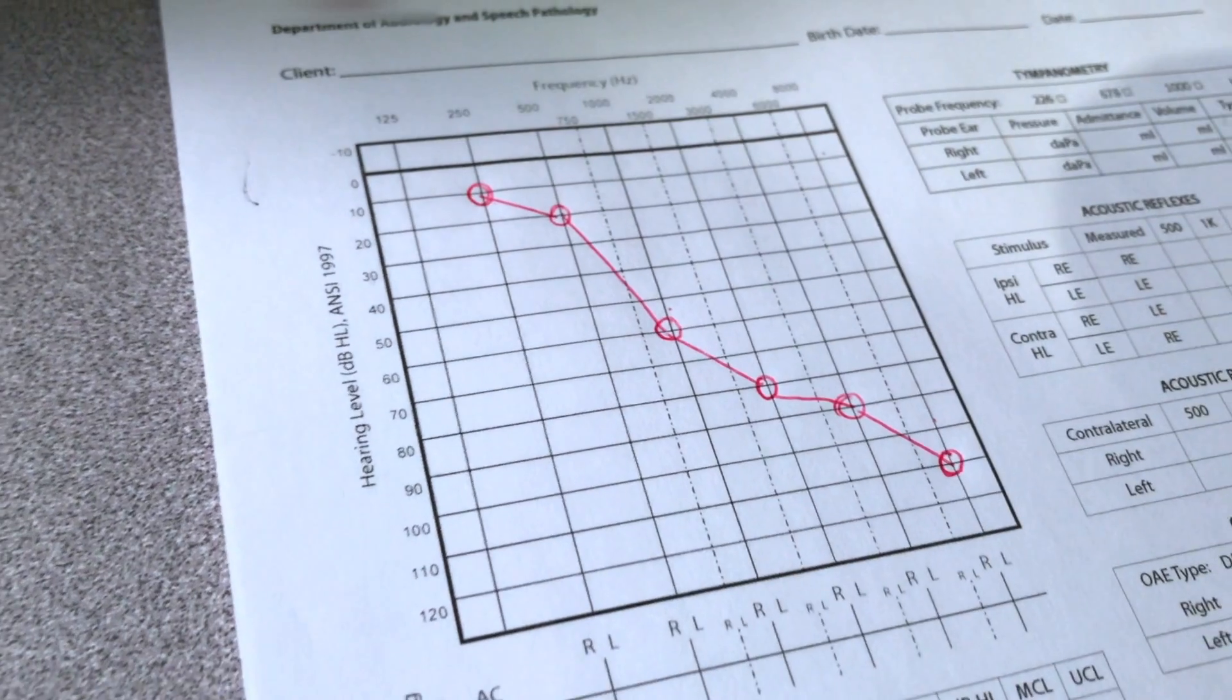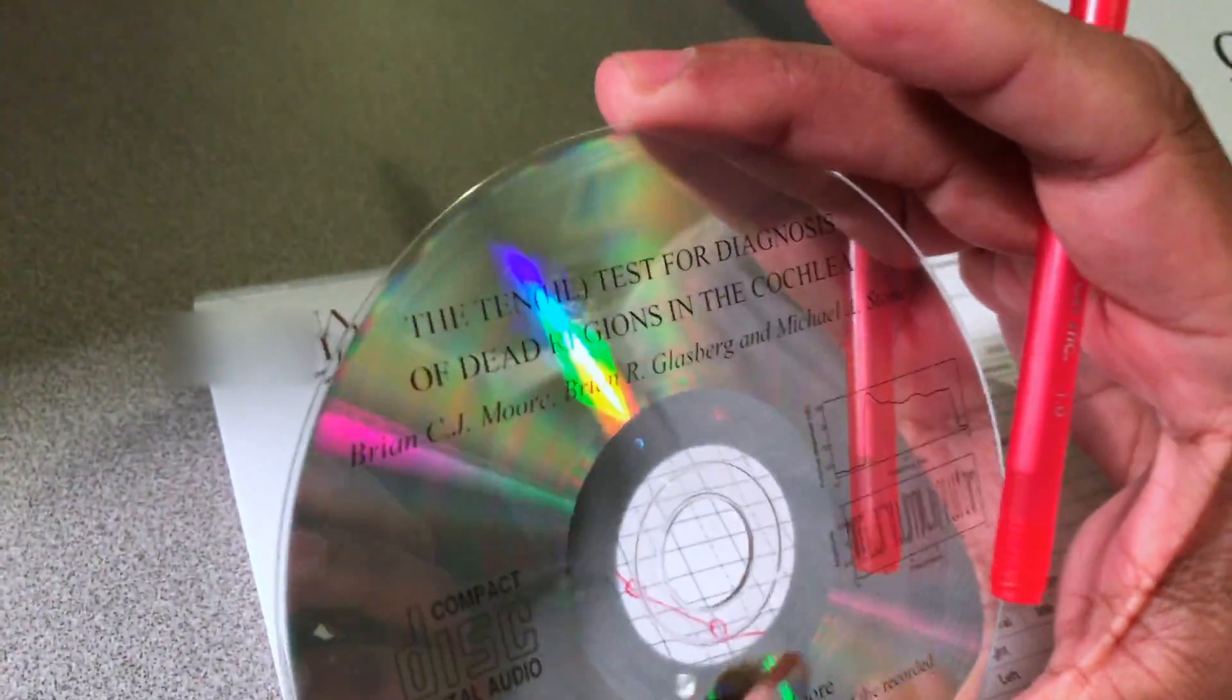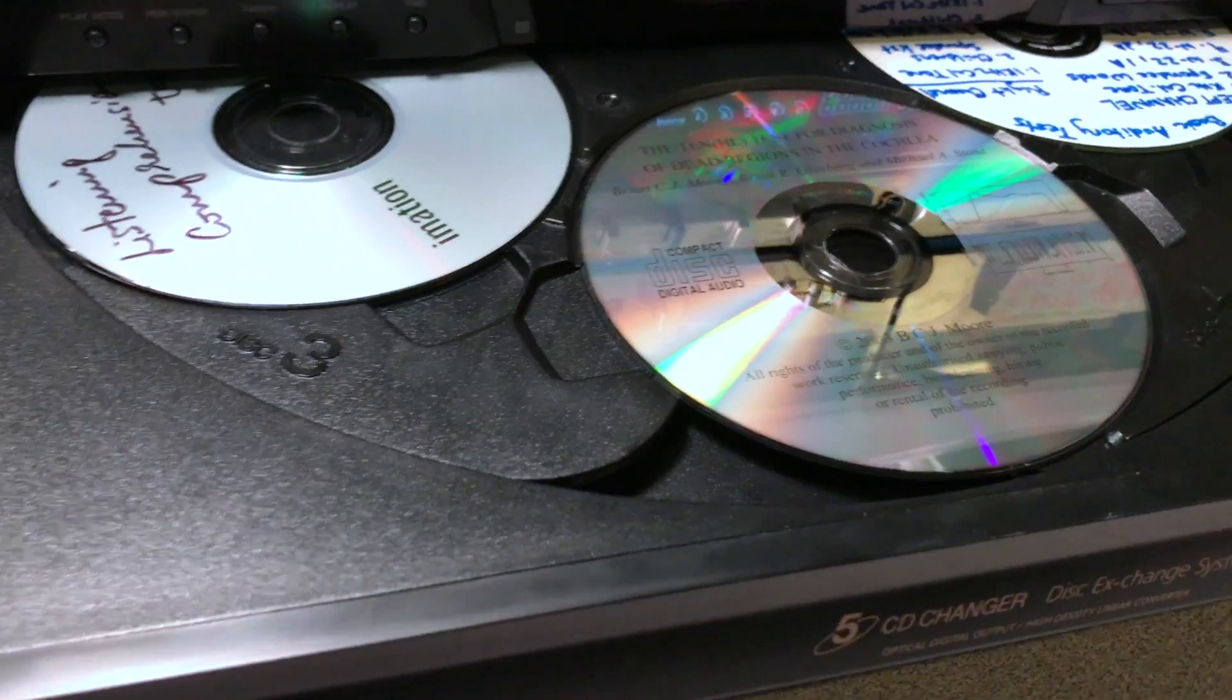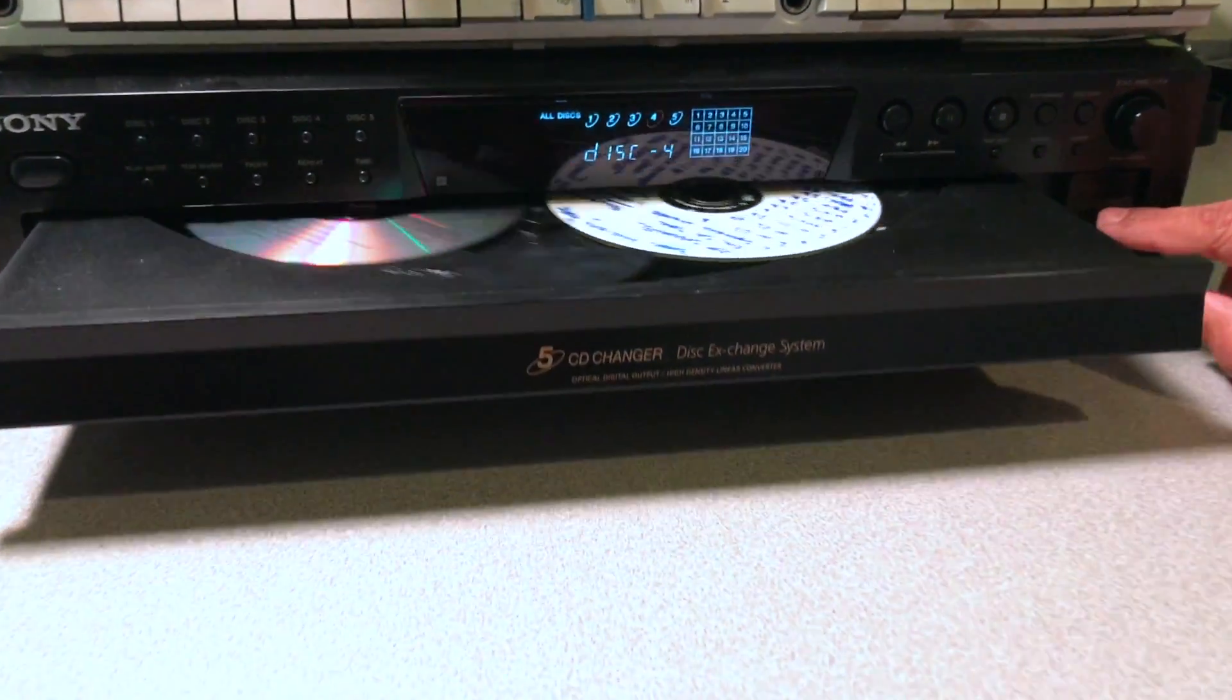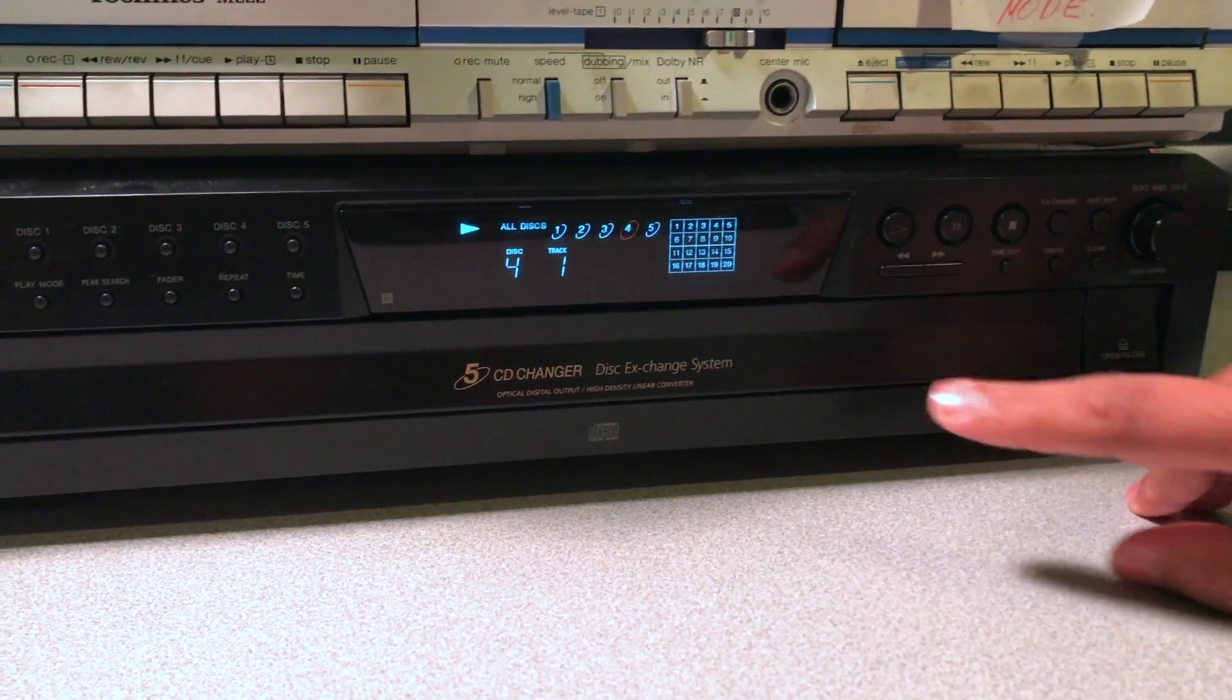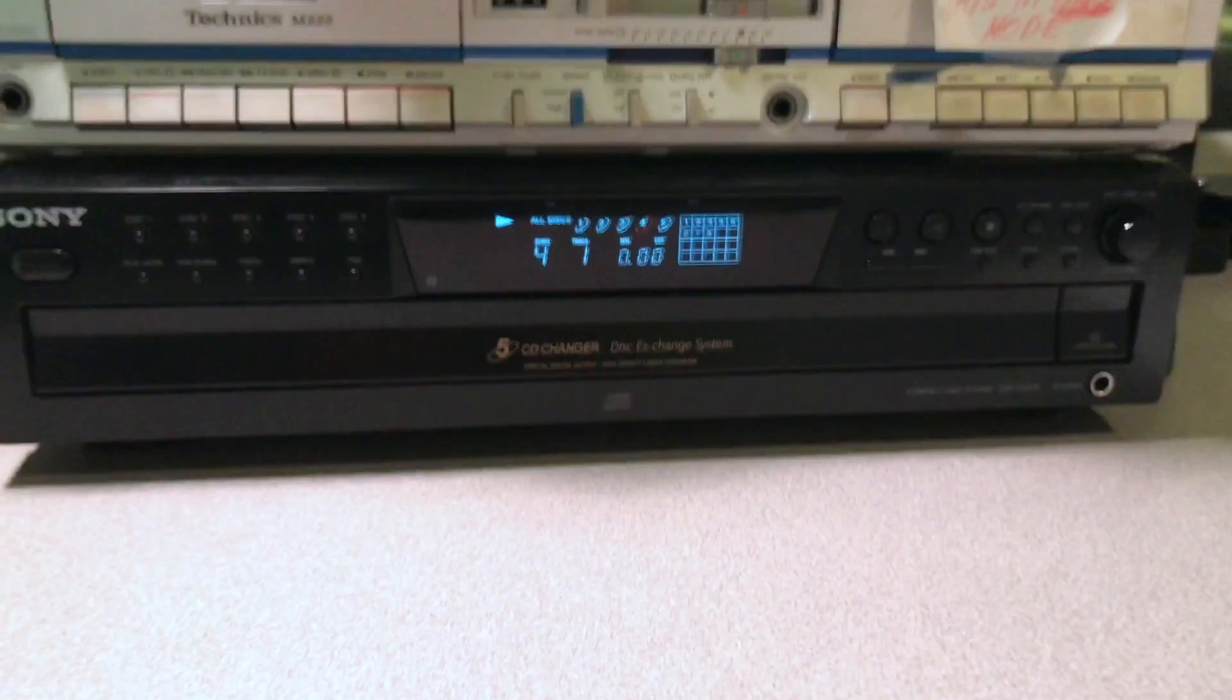Now let's see how to do the TEN test. Here is the TEN test CD. First thing, you need to calibrate the CD. That's basically making sure that the VU meter is set to zero. We have it on this port. Now play the CD, select track 1, which is basically a pure tone presented.